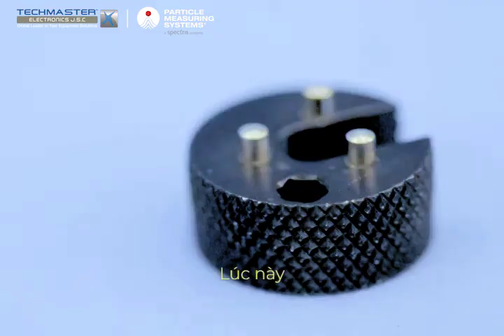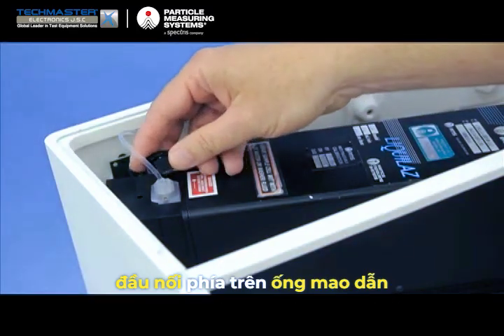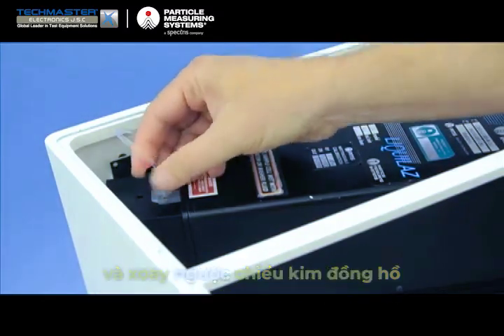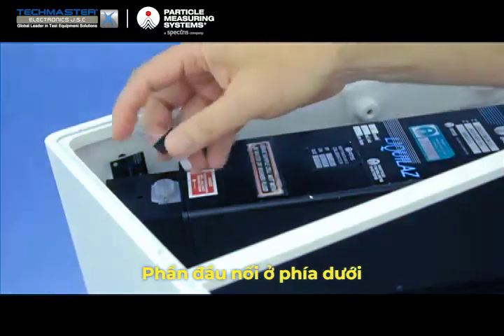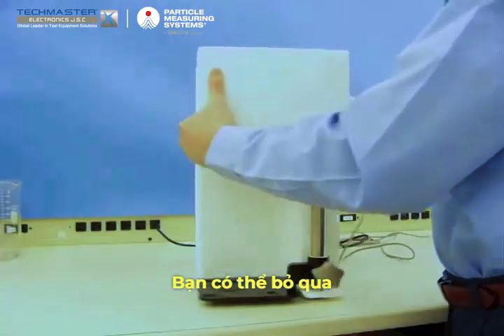At this time, you will need to retrieve the small specialty wrench to loosen the fitting attached to the top of the sensor capillary. Position the 3 small pins to fit in the cutouts on the fitting and turn counterclockwise to remove the fitting. It is not necessary to remove the bottom connection during this procedure. Do not worry about this fitting.